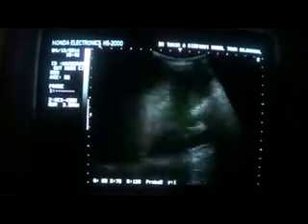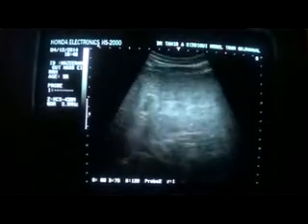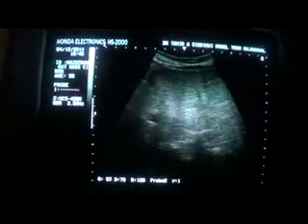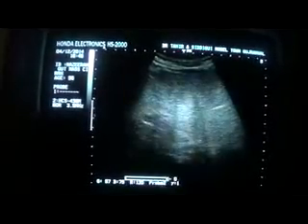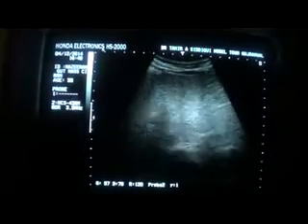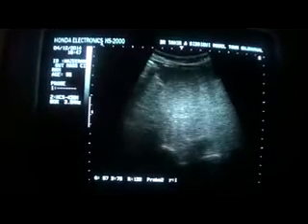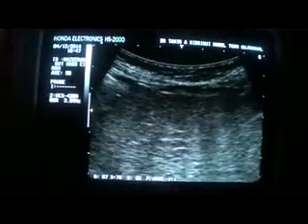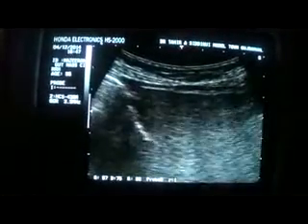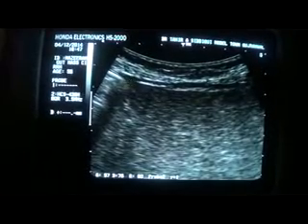and this is the kidney. Kidney is fine. This is the liver texture. Now you can see the coarseness and blurring of the vessels, margins. However, there is mild irregularity of the outer surface of the liver. See, this is the liver outer surface, and it shows mild irregularity.